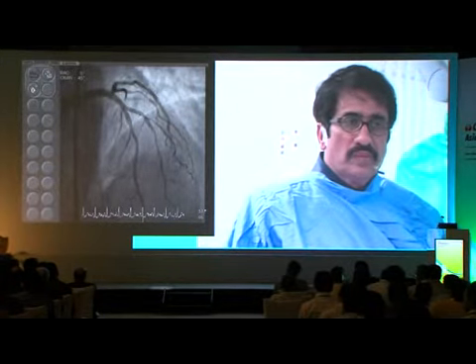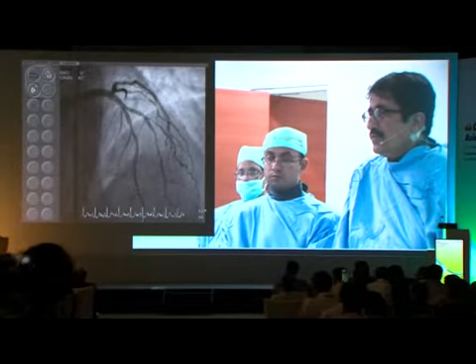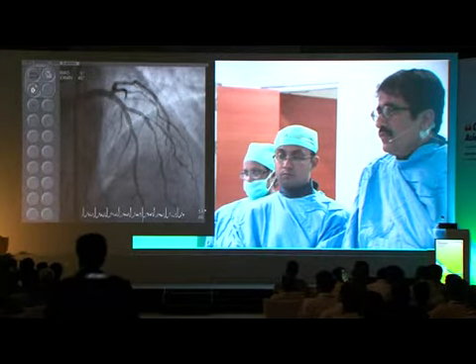We'd like to have a comment from Dr. Khalilullah finally. I think the IVUS showed that the LAD lesion was significant. It was an eccentric lesion, therefore the LAD intervention had to be done. The diagonal also got opened up. I'm sure the patient will benefit remarkably with both these 2 interventions. Although the diagonal is not as big an artery as we expected, maybe over a period of time it might open up better.